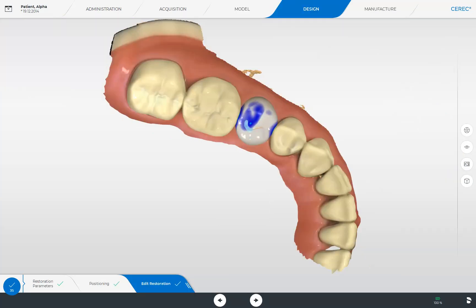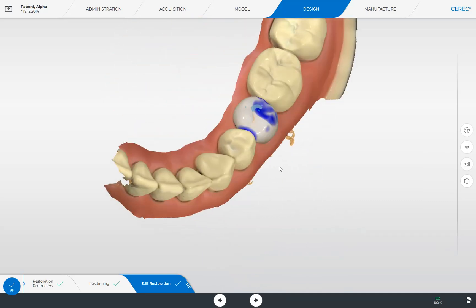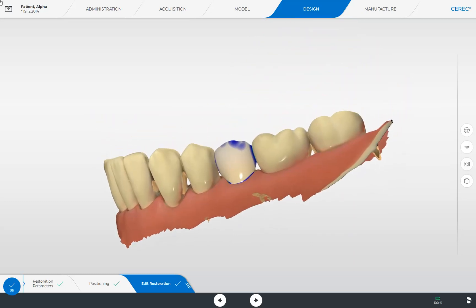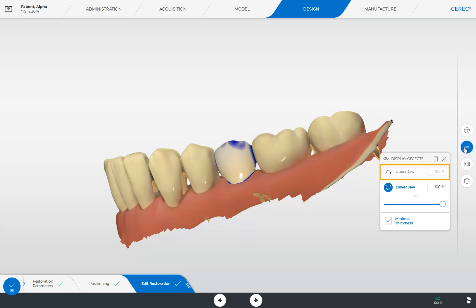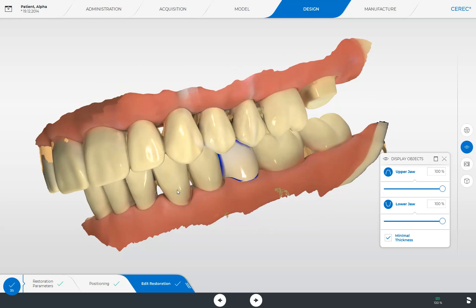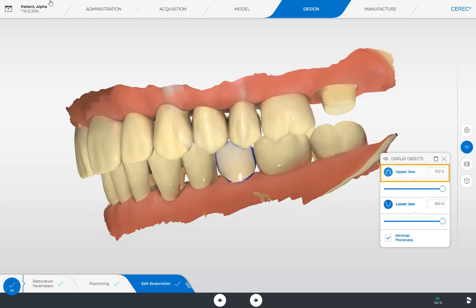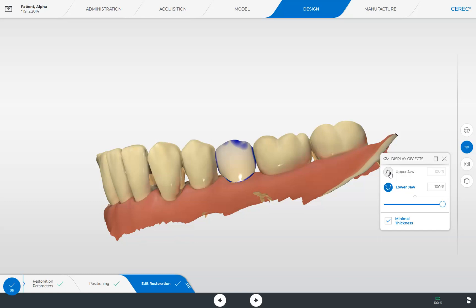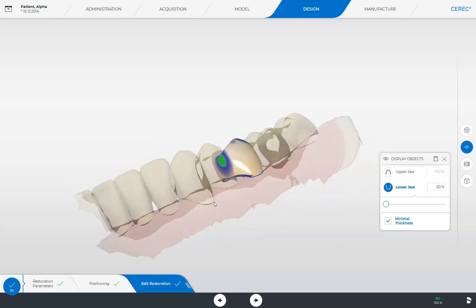Based on the design mode biogeneric individual, the crown has been designed. This phase offers different tools and functions in the side panel for editing the initial design proposal. First of all, we look at our restoration with the upper jaw displayed. To do this, we tap the option Display Objects and activate the 3D model of the upper jaw. We then deactivate the upper jaw again, and next we check our proximal contacts. By reducing the visibility of the lower jaw, we have a clear view of the contact area.